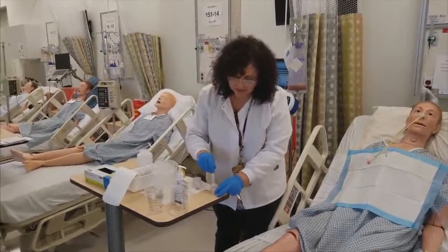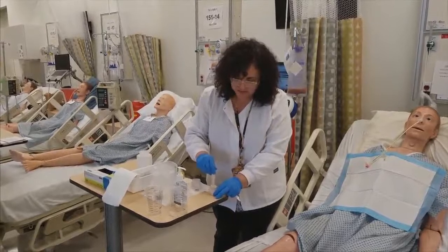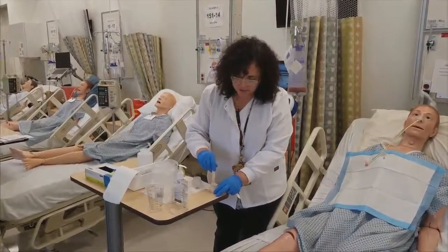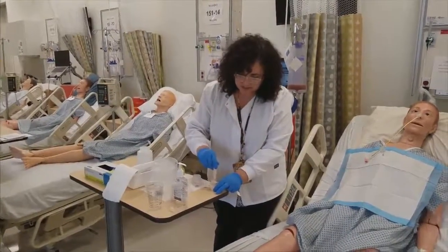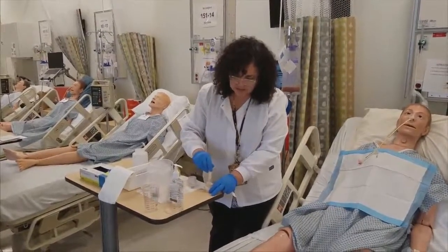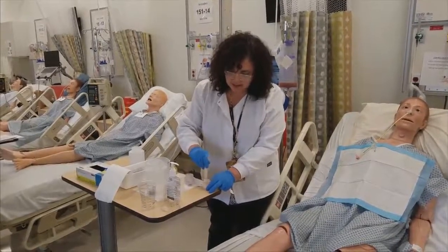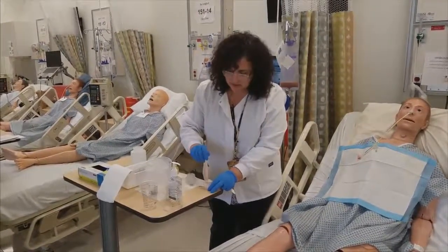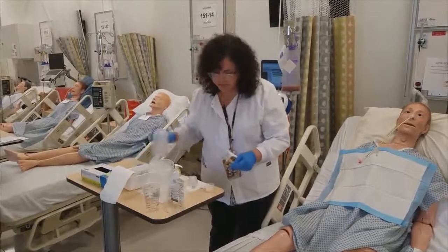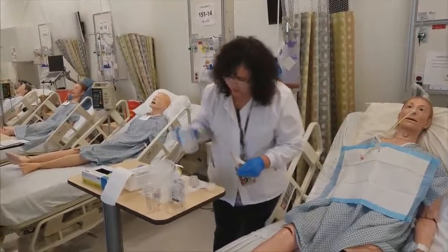So I want to mix each med with 30 milliliters unless I have some kind of fluid restriction, in which case I could probably get away with a little less. All right, but 30 milliliters is a good volume to make sure that this is not too chalky, so that it does not occlude the tube. All right, so I'm going to pour off the rest for a total of approximately 30.